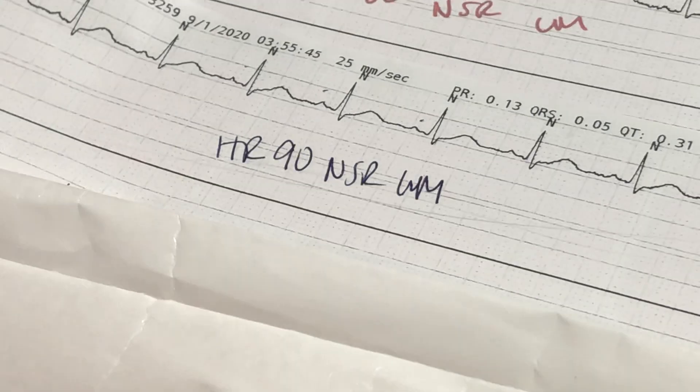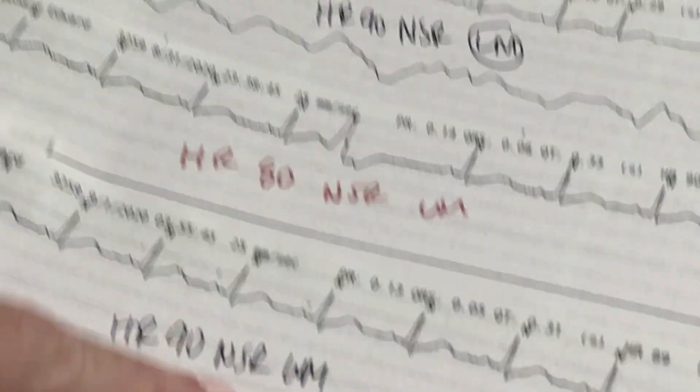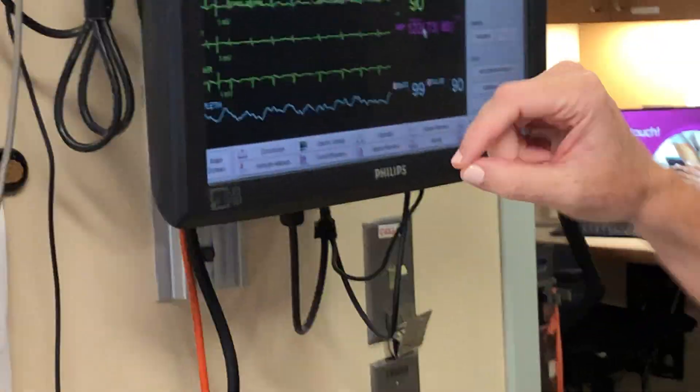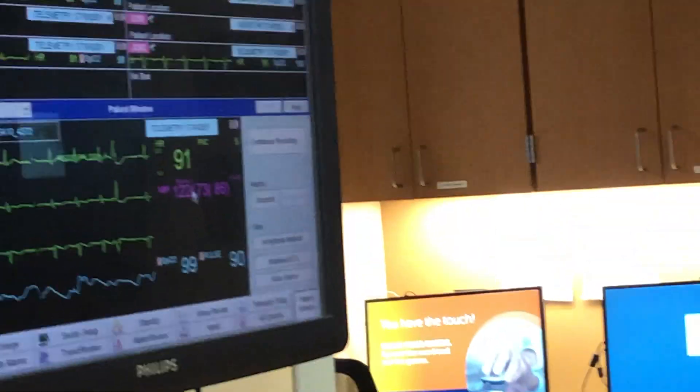You can see it doesn't always print out on the strip, but you'll still see it. This person is having occasional PVCs. We'd call the doctor or provider for that — but you don't have to call for everyone. If it's new, call and let them know. For something like a heart block that's new compared to prior strips, definitely notify them.